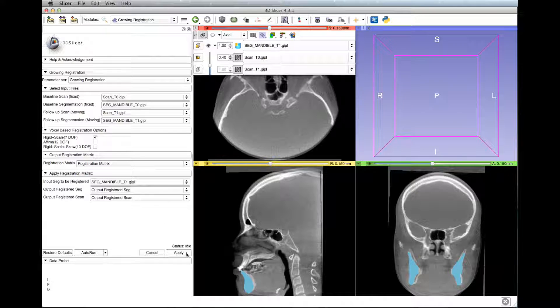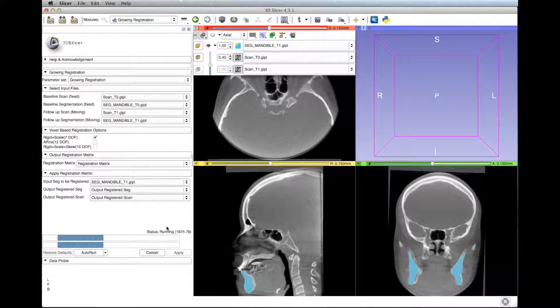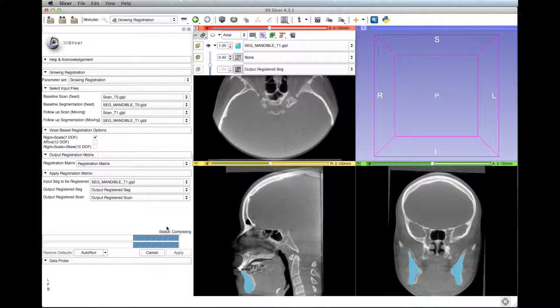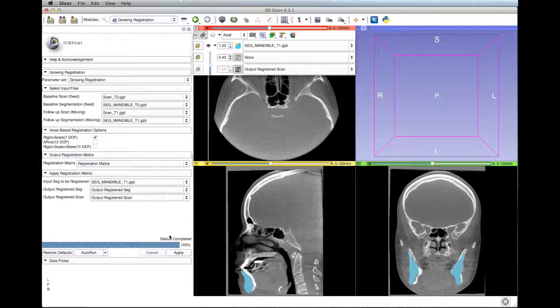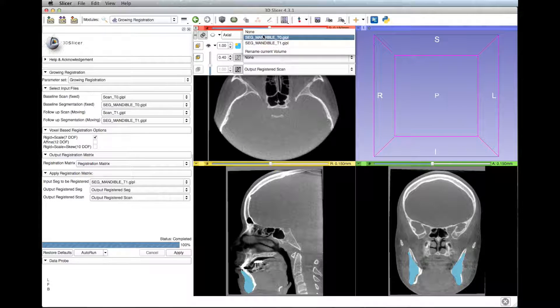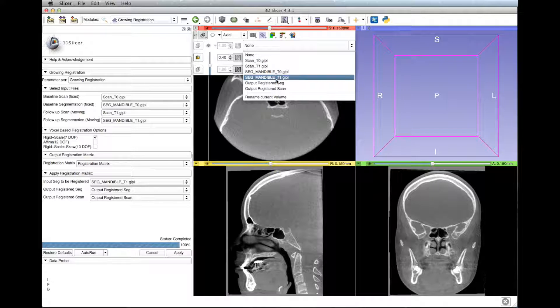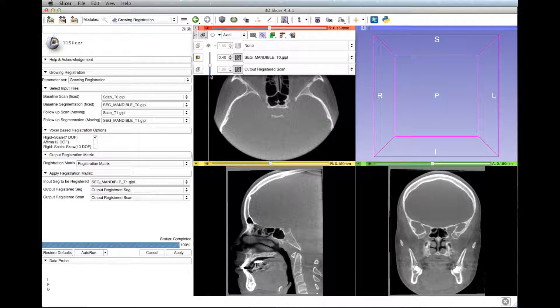This may take a while to complete — here we speed it up quite a bit. You can check the results by comparing the T1 scan with the output registered scan by clicking the tiny pin icon, then selecting the rings, and clicking the double back caret option if it hasn't been selected yet. Then select the scans and move the crossfade bar up and down to change the transparency.